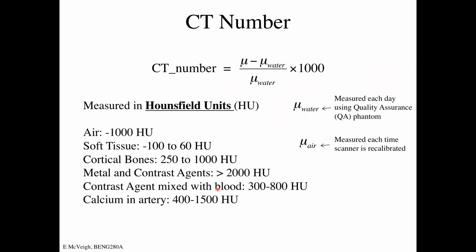When we create the picture, we'll just look at what the pictures look like first. We're going to reconstruct the linear attenuation coefficient value. And early on when this was first created as a medical imaging device, it was thought, well, these are floating point numbers, they're real numbers, mu values.